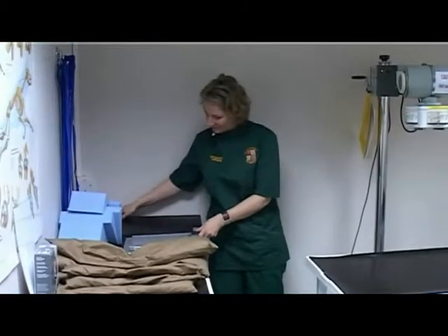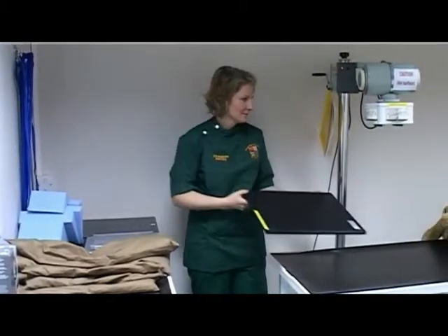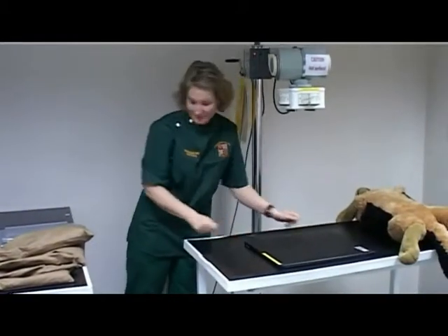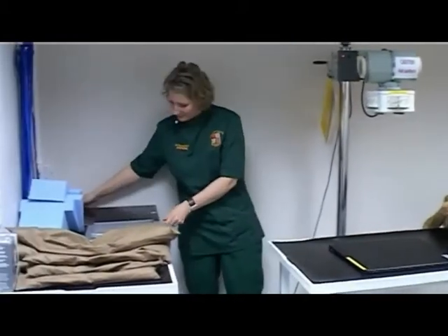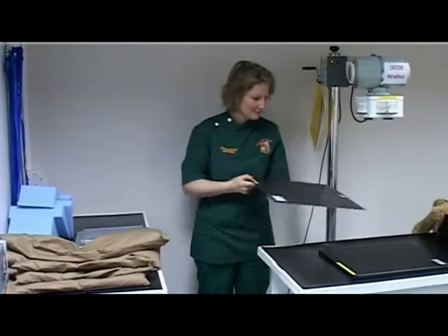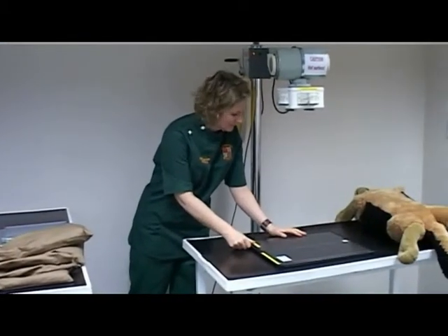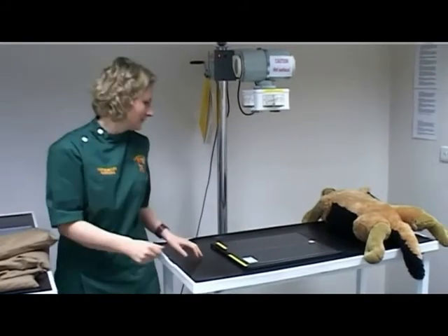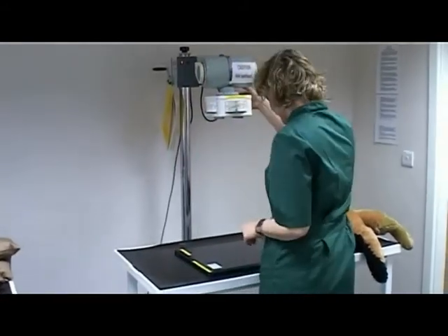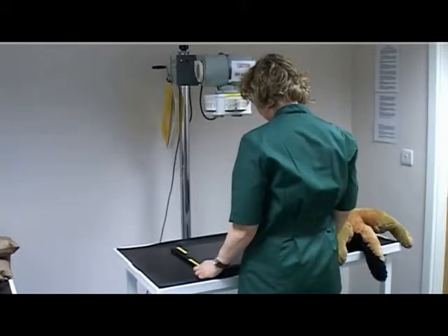Select a large size cassette and place it the correct way up on the table. Select an appropriate size stationary grid and place it exactly on top of the cassette, ensuring it is the correct way up. Collimate within the edges of the grid.